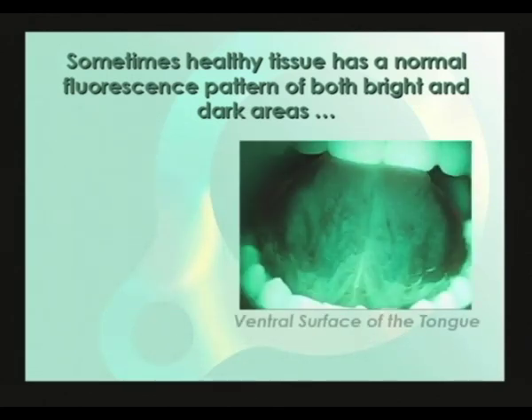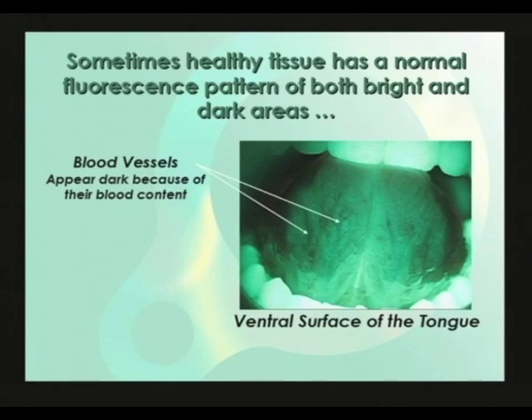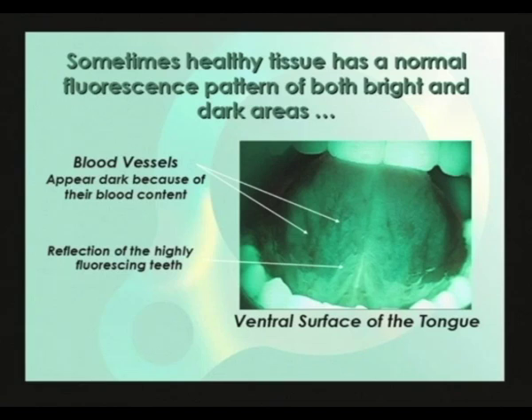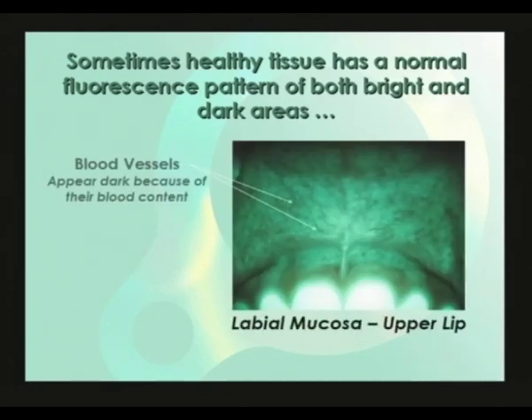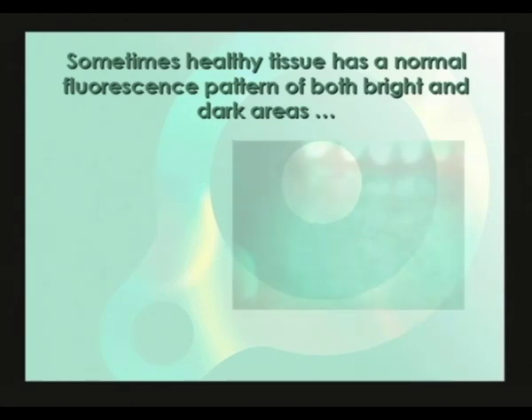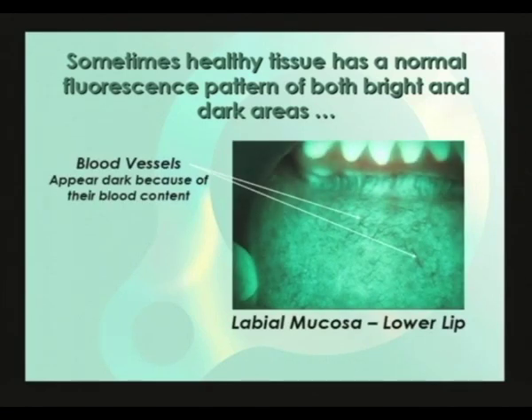Here we see the blood vessels on the ventral surface of the tongue, which appear as dark lines under Velscope, again due to blood absorption. On the lower portion of the tongue, notice the white reflections from the highly fluorescing teeth — watch out for this, as in some situations it may be confusing. This is an image of the labial mucosa on the upper lip, the blood vessels again showing up dark under Velscope. The labial mucosa on the lower lip presents similarly to the upper lip.